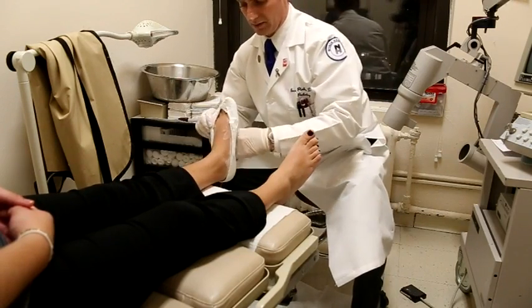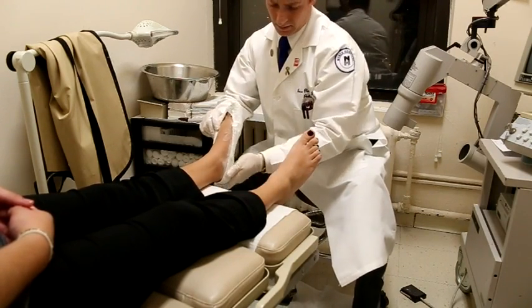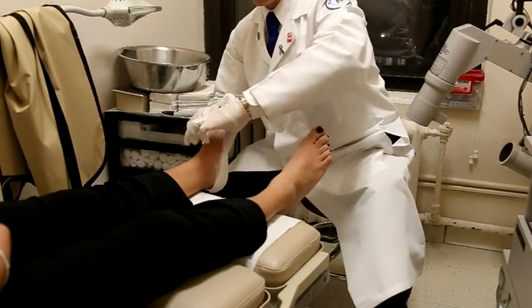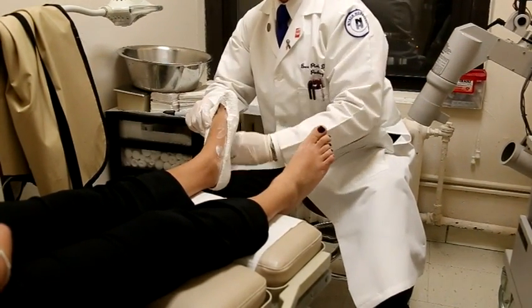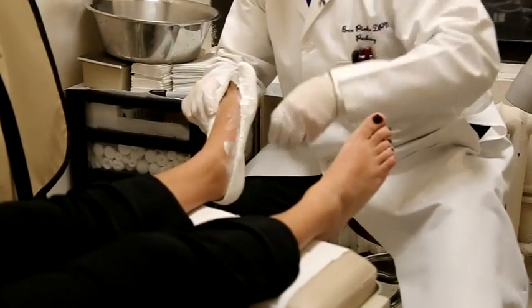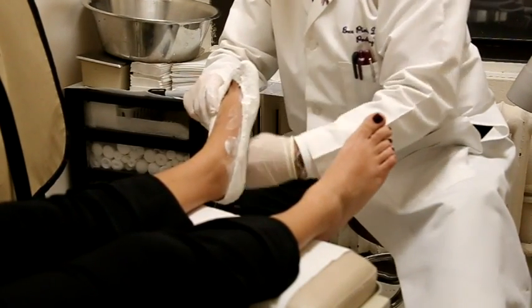Range of motion, biomechanical. And then we cast the patient for the orthotics, or the subject here, in the neutral position, which is where we have her positioned right now.